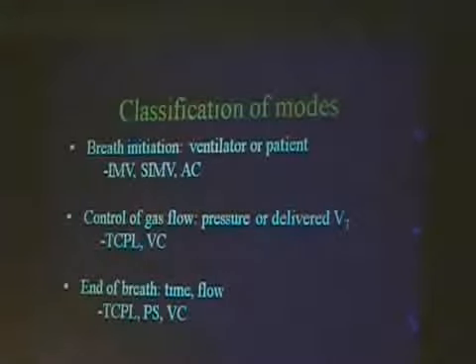What's initiating the breath? Is it the ventilator or is it the patient? Intermittent mandatory ventilation: what initiates the breath? It's the ventilator, because there's no synchrony. We don't use IMV anymore unless the baby's paralyzed or neurologically damaged. None of the ventilators have an IMV mode per se. You have to set the synchronized mode, but you can set a rate that the ventilator will say, okay, I've got to breathe this many times.